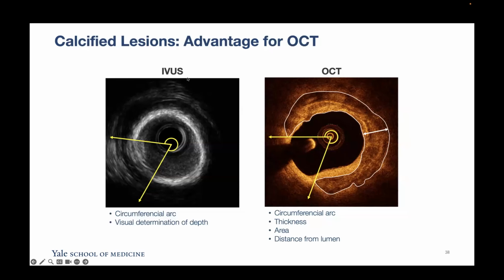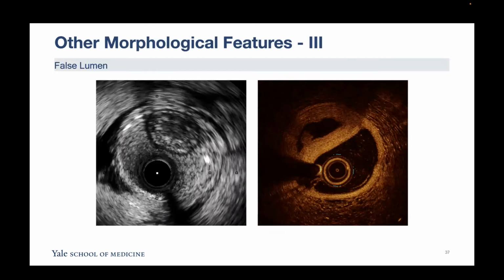If you are suspecting a dissection, is it safer in principle to use IVUS versus OCT, just because you're not giving an injection? Yeah, that is a concept that has been around for a long while. I was wondering, because many times you have dissections like this and you don't recognize them, so you inject 3 or 4 times in angio in different views trying to identify it, and we don't think about that.